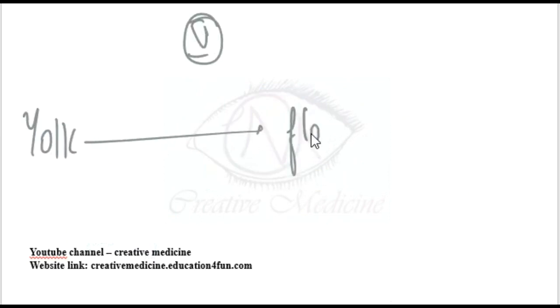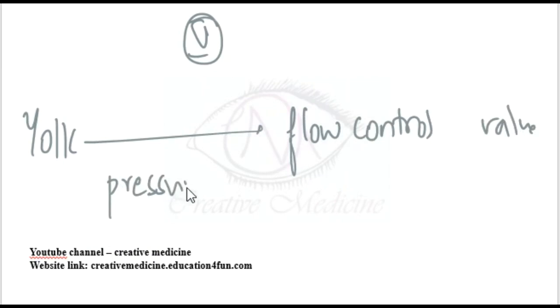Three things are present in intermediate pressure system, that is pressure controlling valves, fail safe valves, and oxygen failure alarms are present. Low pressure system.